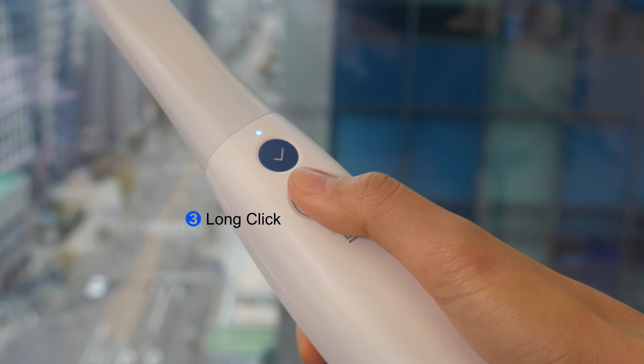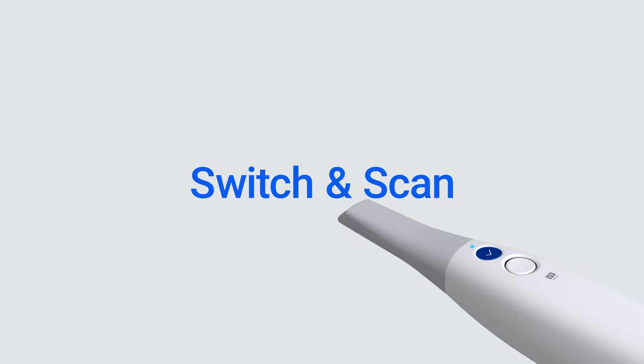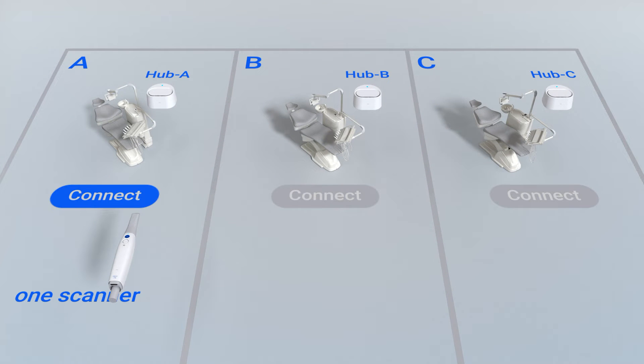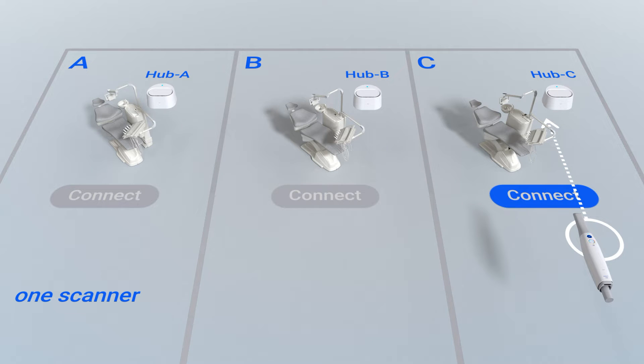For the last option, it can be used as a long click. You can use the switch and scan function when you click and hold the center of the control button. The switch and scan feature allows you to connect a single scanner to two or more wireless hubs and switch between them. This feature makes it convenient for clinics to connect scanners to multiple wireless hubs.